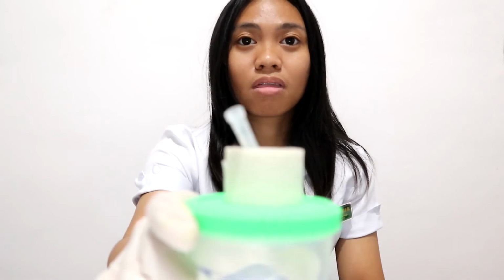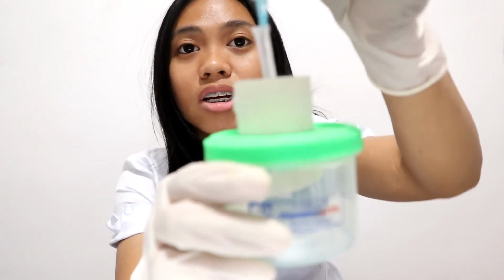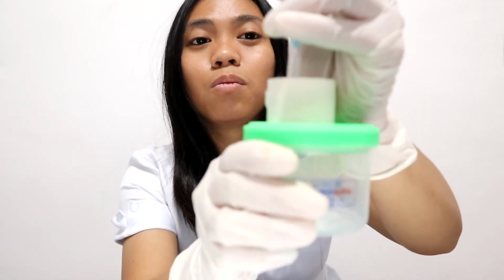So, as per my strategy, at the start of my venipuncture, I place the cap of the syringe inside the micropore. Here. So, it will be in a standing position, which will make it easier for me to seal the syringe back. So, when I'm done doing the venipuncture, I will just insert the syringe into the cap this way without holding the cap.